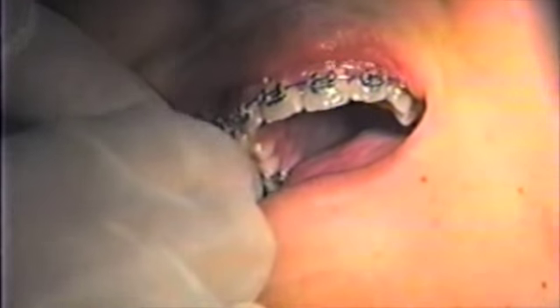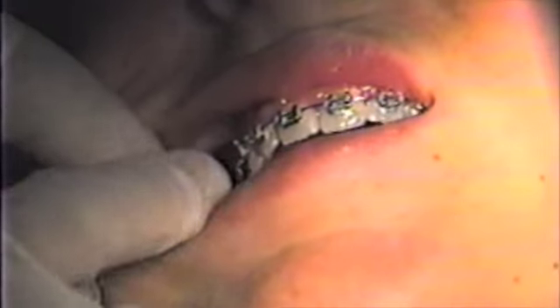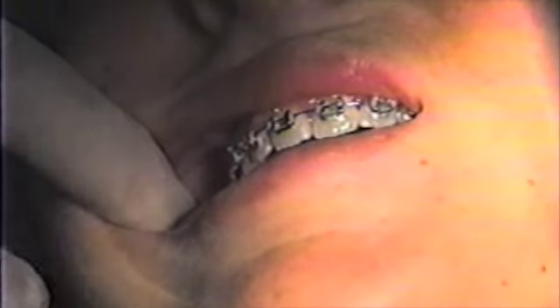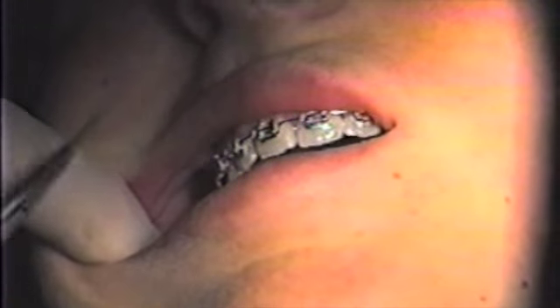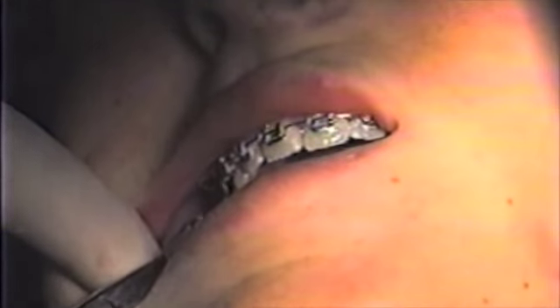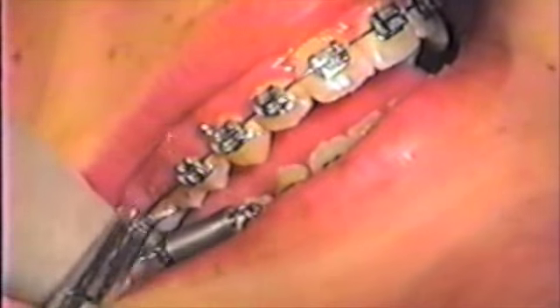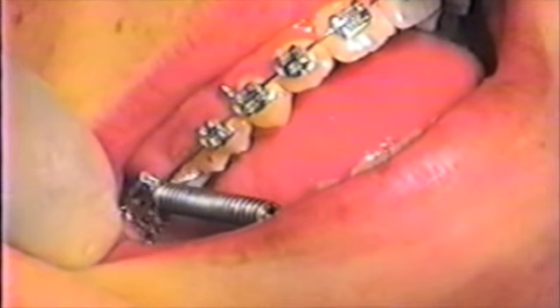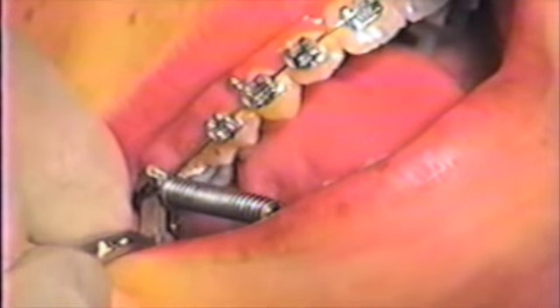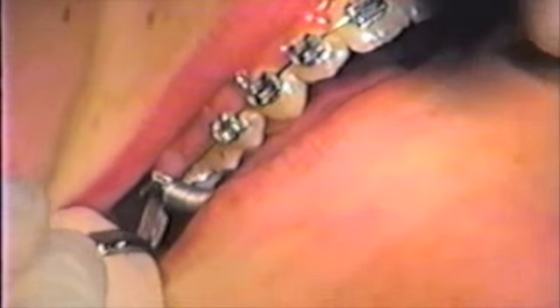On this case, I was unable to gain attachment to the molar, so a Kobayashi ligature wire was used to place around the molar headgear tube. The hook was also bent in place with a band pusher.